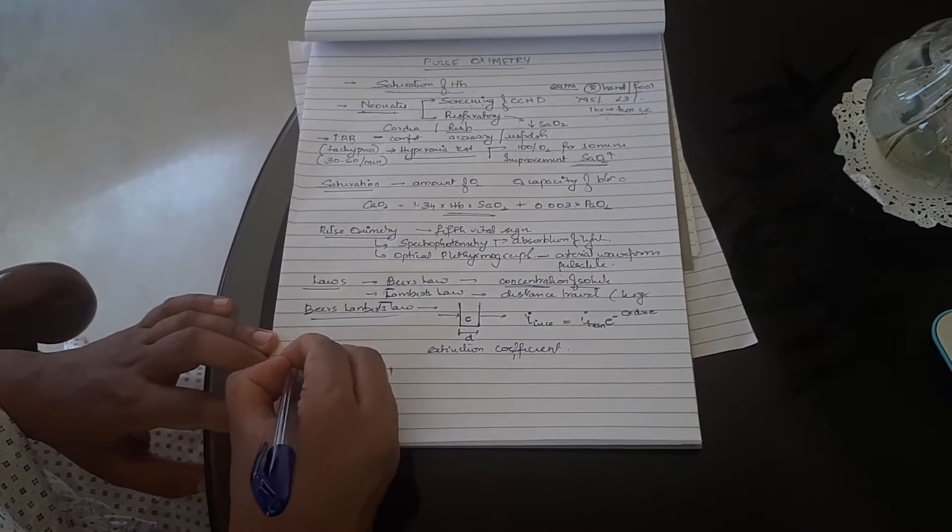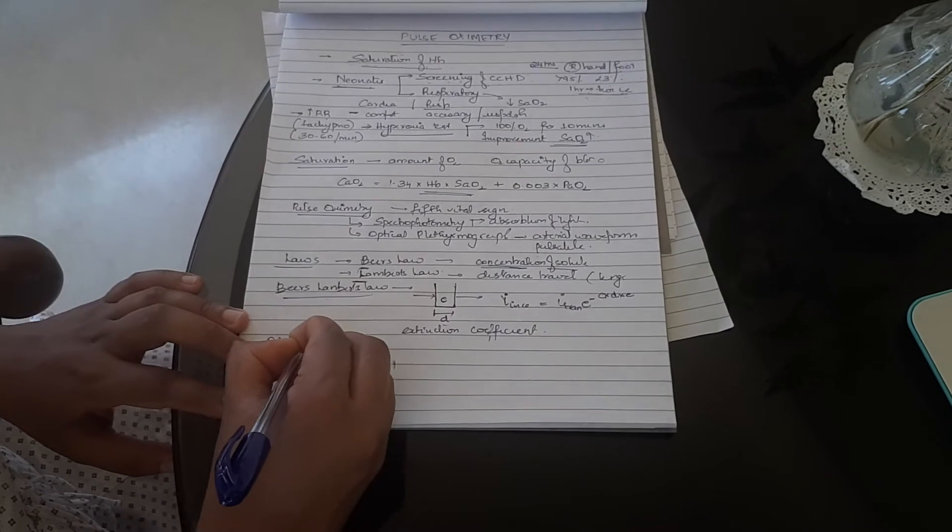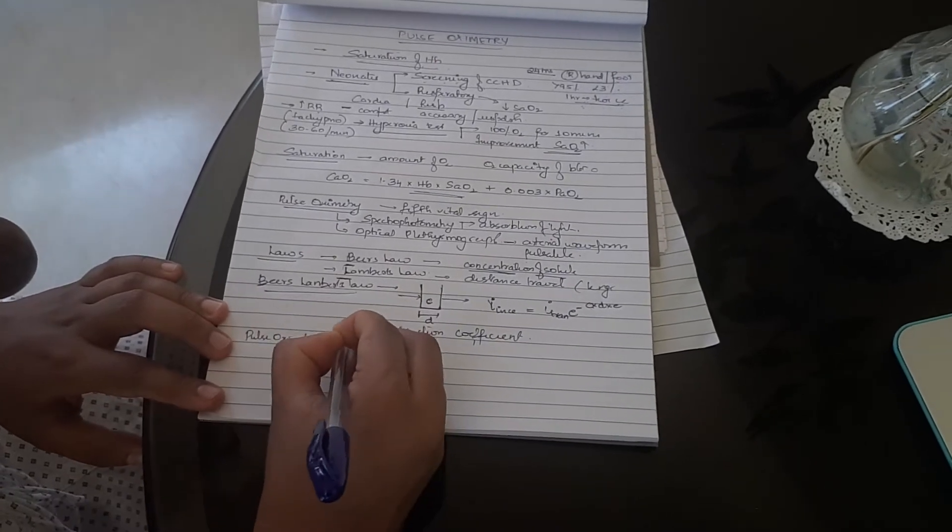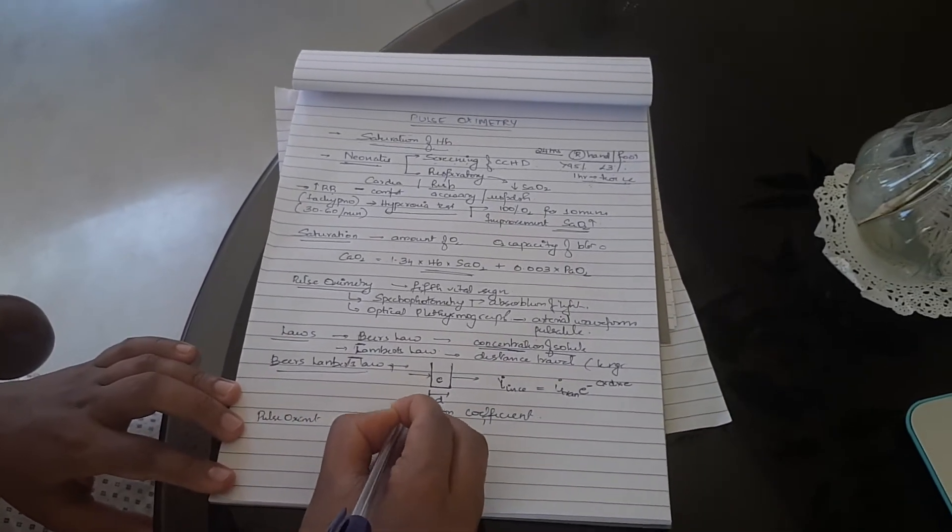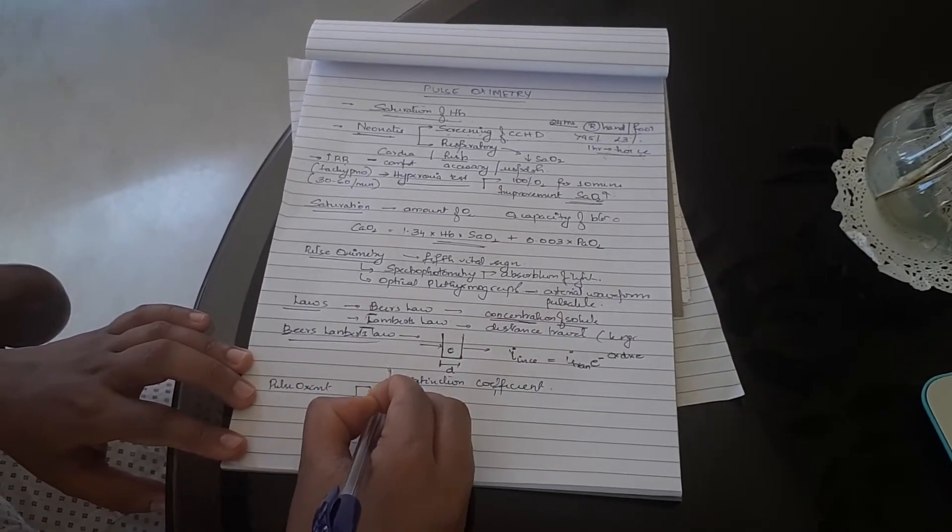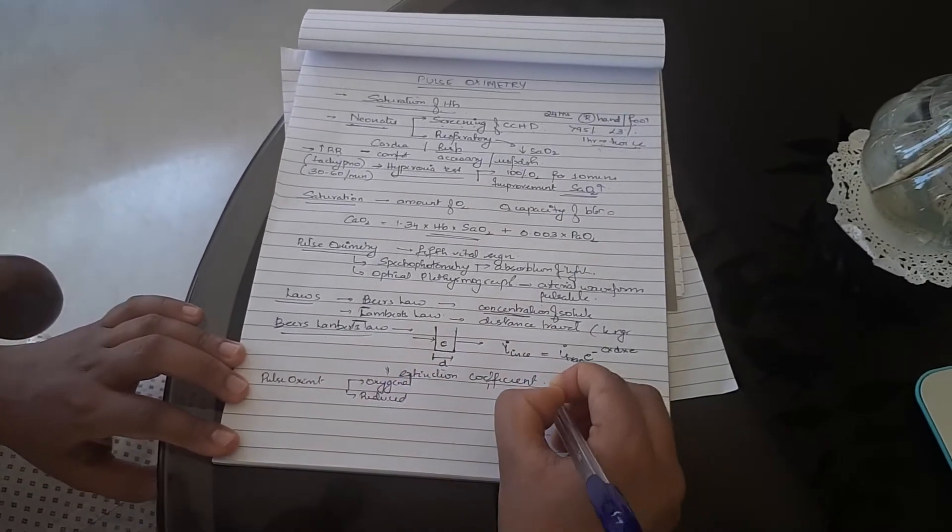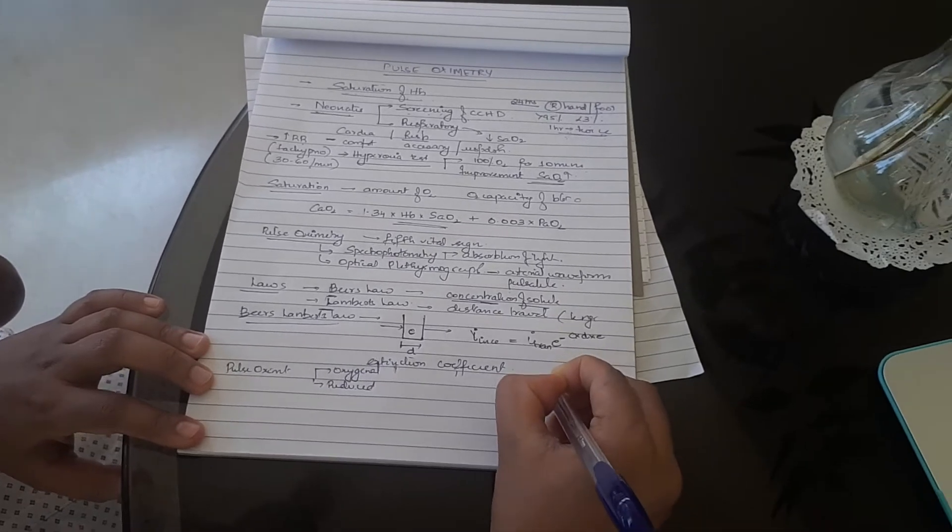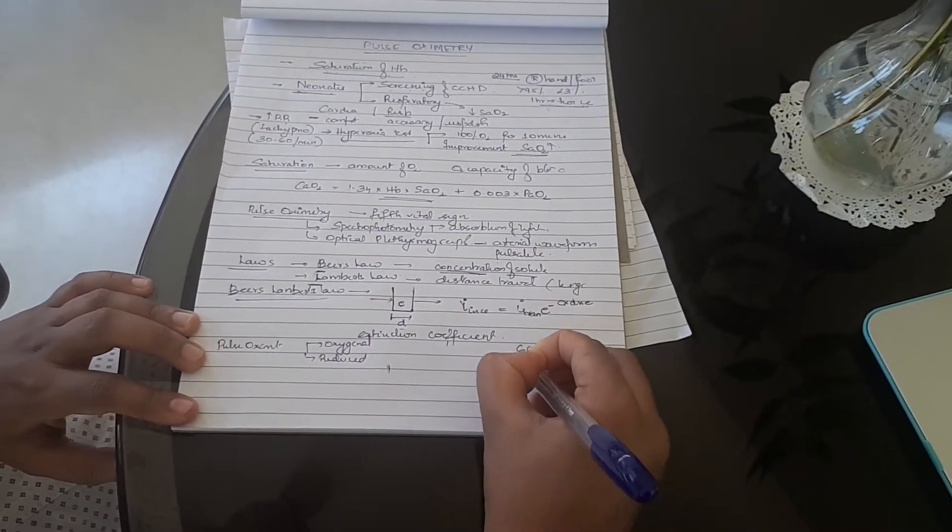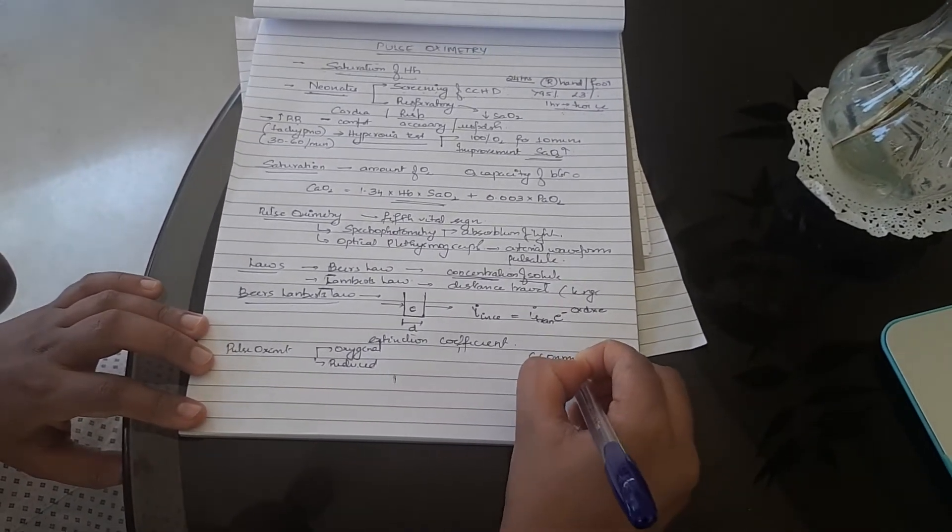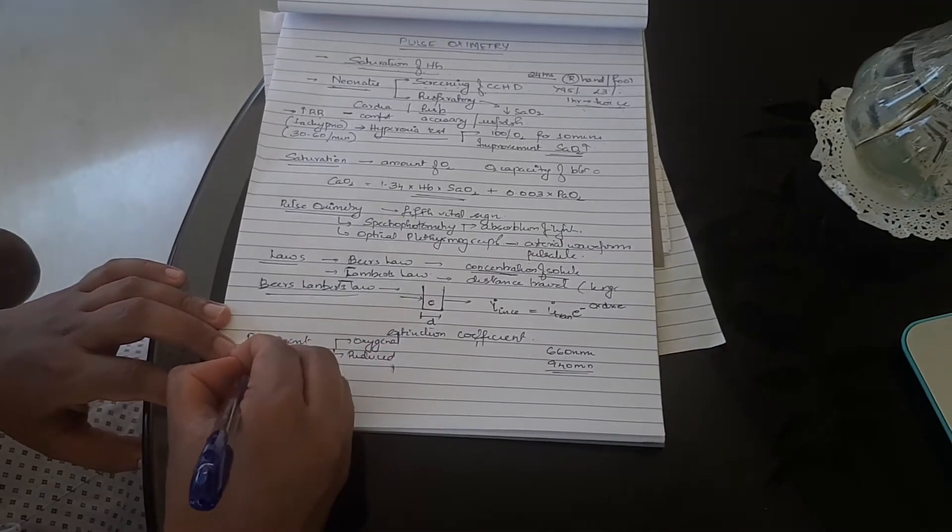Now when it comes to pulse oximetry, what are we bothered about? We are bothered about oxygenated hemoglobin and reduced hemoglobin. For this we use two wavelengths: 660 nanometers and 940 nanometers. Now how do you remember this?